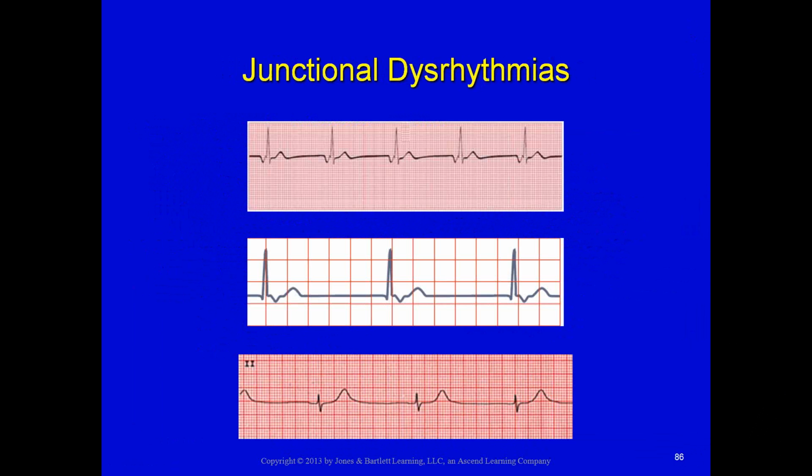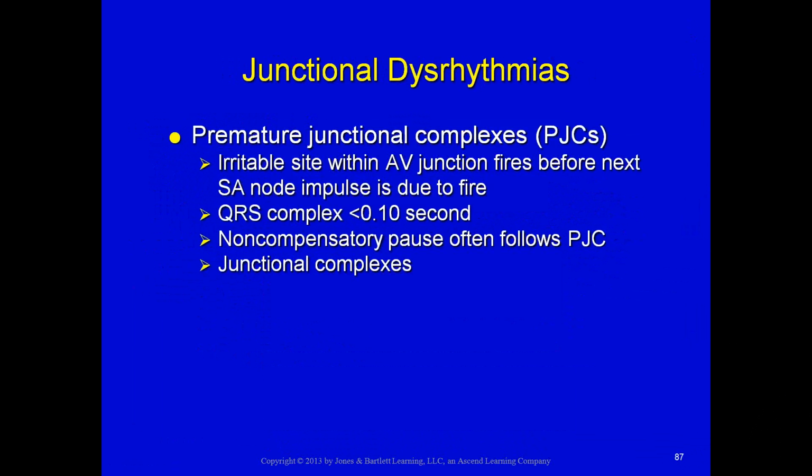And if you look at that very bottom strip, there are no Ps at all. I just have QRSs and Ts. And because I have no P waves at all, that's telling me the ventricles and the atrium depolarize at the same time. And the electricity generated by the ventricle depolarization obscures, or hides, the electricity of the atrium.